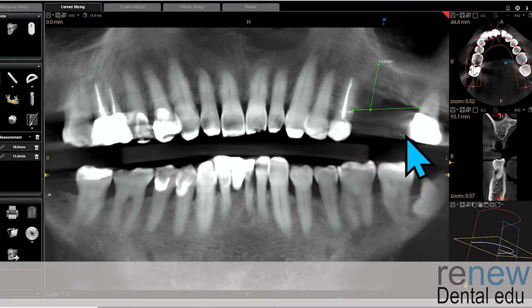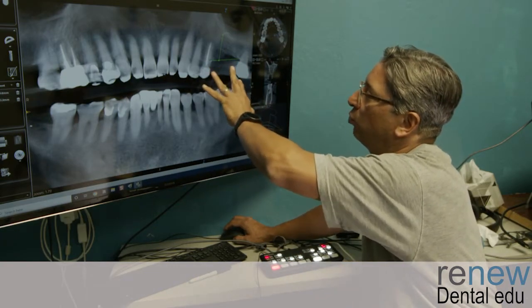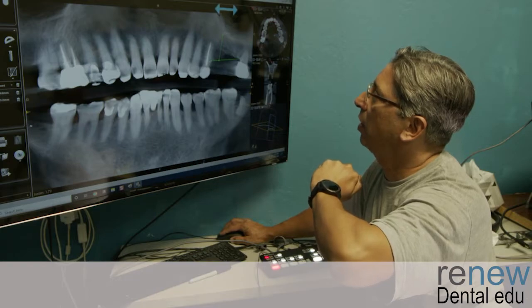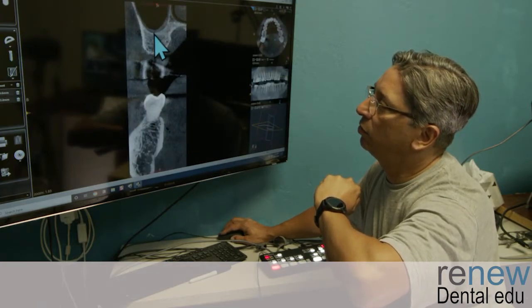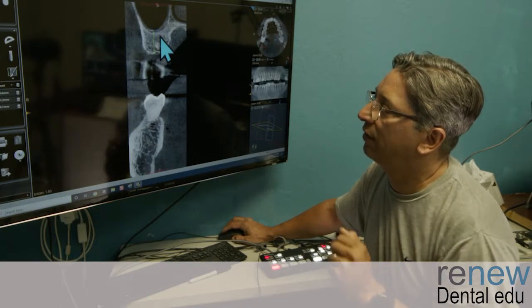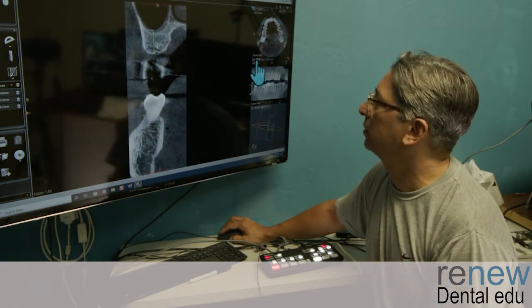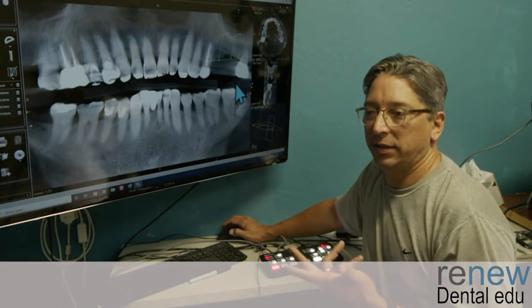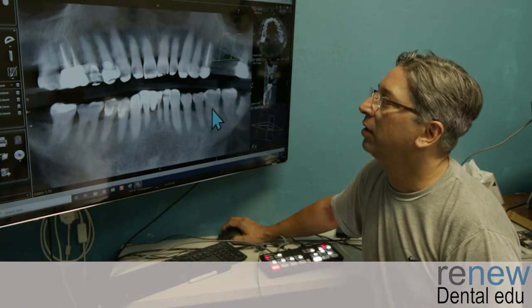So either they take it out so they don't have a reference and then there's no gap. It just ends right here and you don't have to worry about anything there. But, you know, here's where the patient can open up wide. He's got a fairly long arch. And if you're inclined to put one in there, you do have enough room. Maybe, let's just measure this real quick. You do a 10 millimeter implant. This is 8.7. You do a little bump into the sinus. You put a 5x10 here. That would be adequate for that site. And then you have 2 implants that go into this area here. So that would restore it, maintains that feeling for the patient with that third molar, doesn't create some gap issues that they'll complain about later, and that would be it.